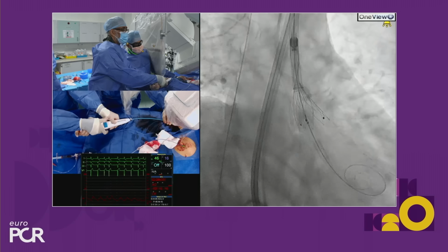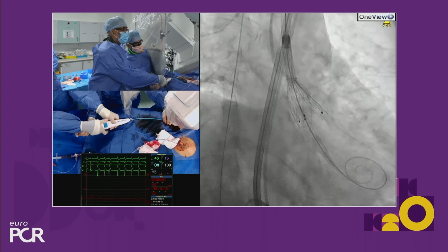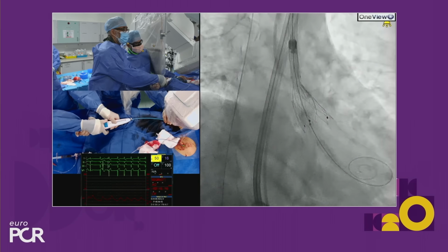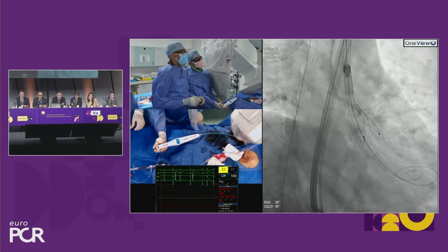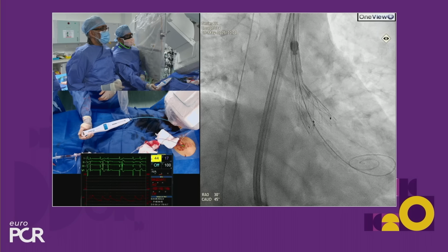So at this point, to keep it in position, you don't pull on the device, you push on the wire. Yeah, it's definitely looking very good. If you pull on the device, it makes it coaxial. Putting some less effort in there. We've got to the hard stop there. Okay, so the heart rate has gone down a bit, but it's recovering.